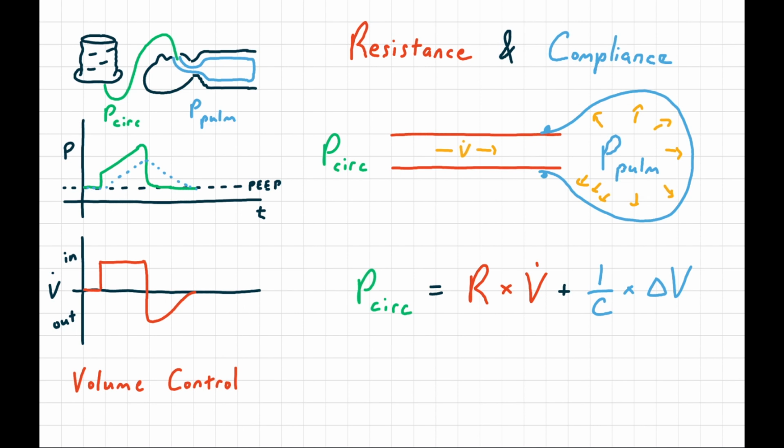You'll see that the peak pressure on your ventilator circuit pressure, that's this point at the end of inspiration, where the circuit pressure is highest, is getting too high. And the question is, if your pressures are getting high, you know either your resistance has gone up or your compliance has gone down. And either one of these is a bad thing, but they describe two different pathologies with potentially different treatments. If your resistance has gone up, that represents obstructive disease, an asthma exacerbation, COPD flare, swelling in the airways, or maybe a mechanical obstruction like a kinked endotracheal tube.